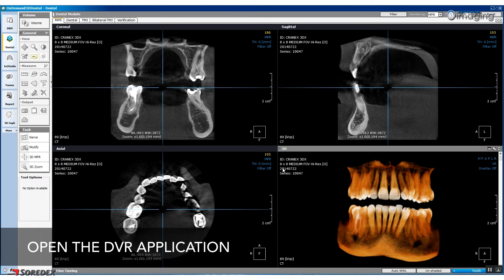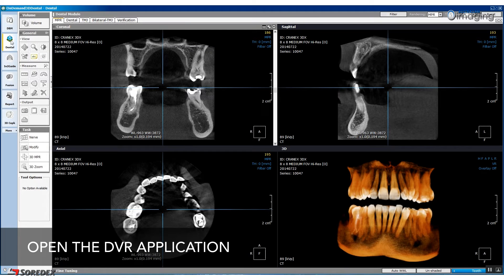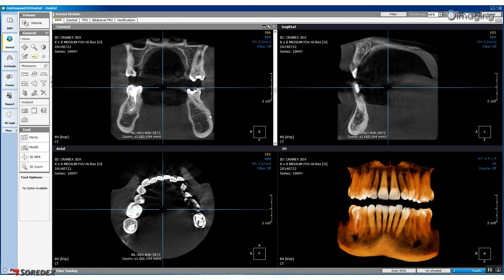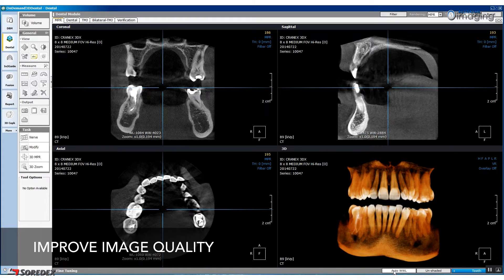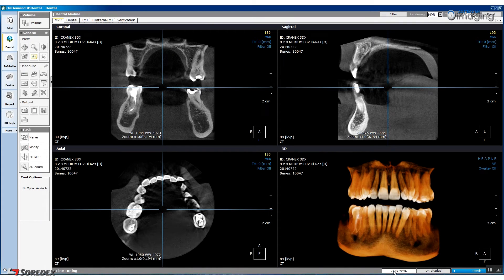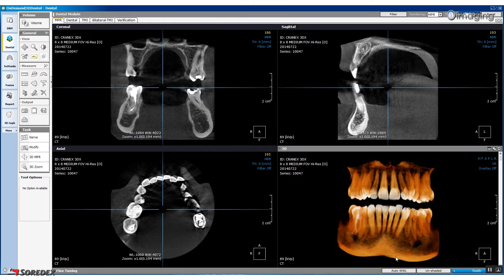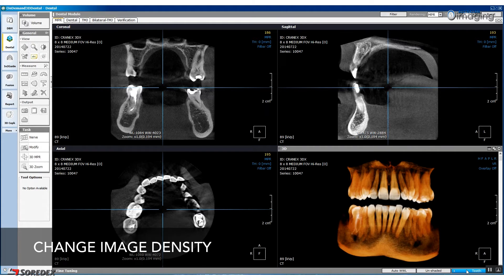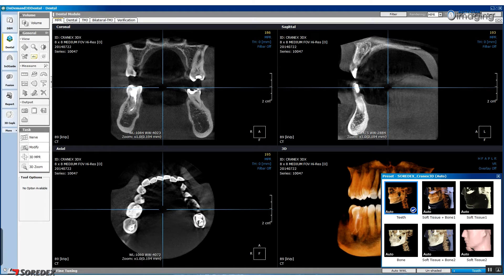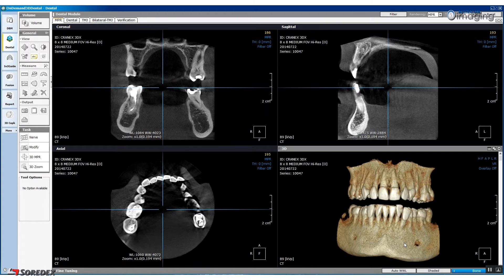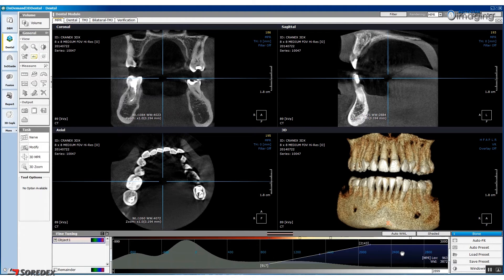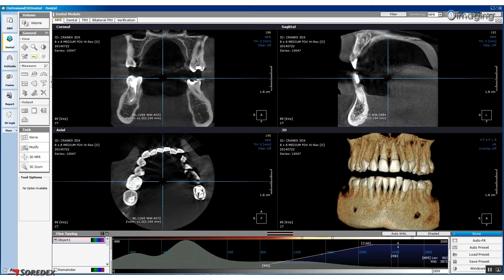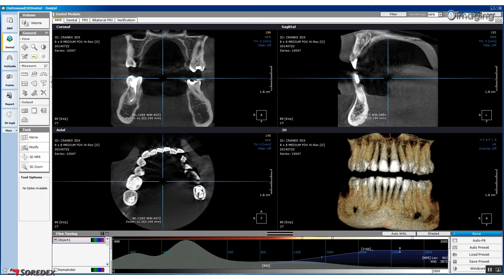To begin analysis, open the Dental Volume Reformat or DVR application. Whenever you are working with a new image, press the Auto WWL button to create the best quality image. To change the density of the 3D rendered image, click the Teeth button and then select the Bone option. Following this, click the grey Fine Tuning bar to bring up your adjustment options. By moving the horizontal axis you will be able to adjust the density of the image, and by moving the vertical axis you will be able to adjust the opacity of the image.